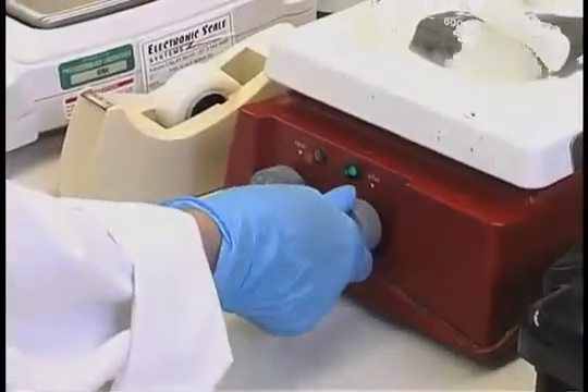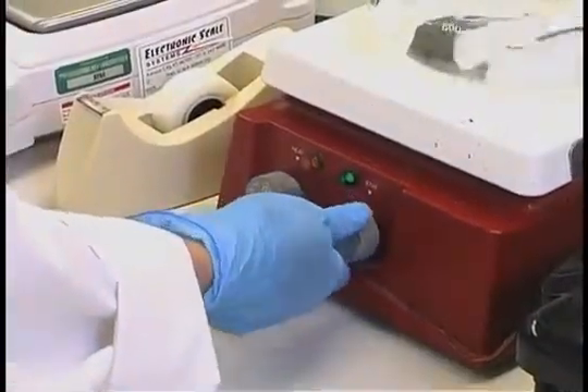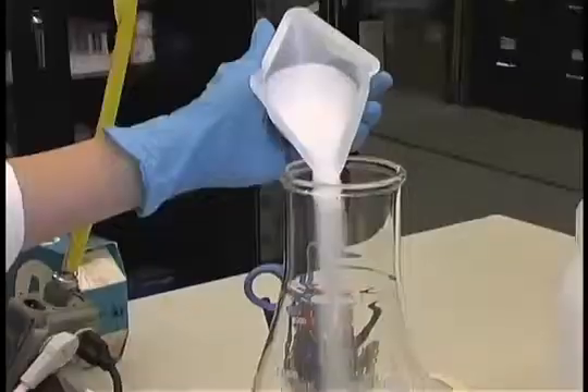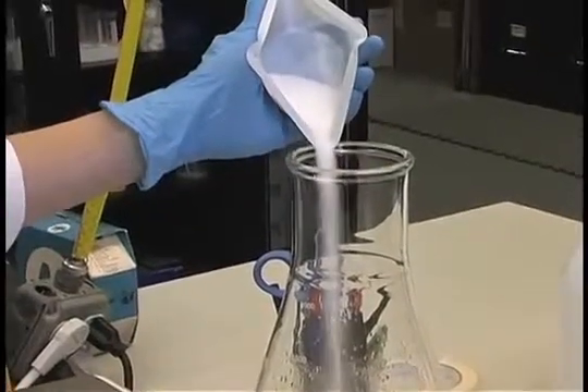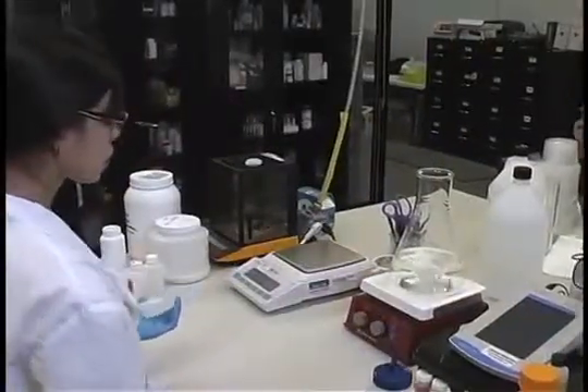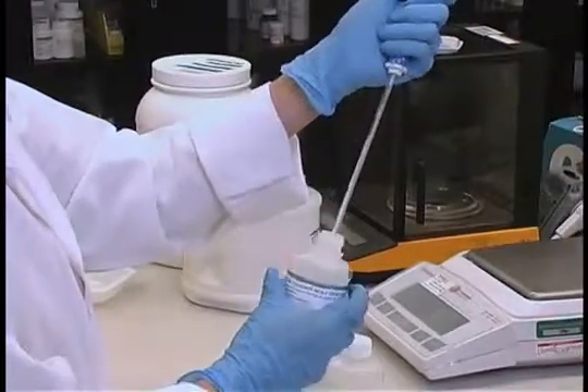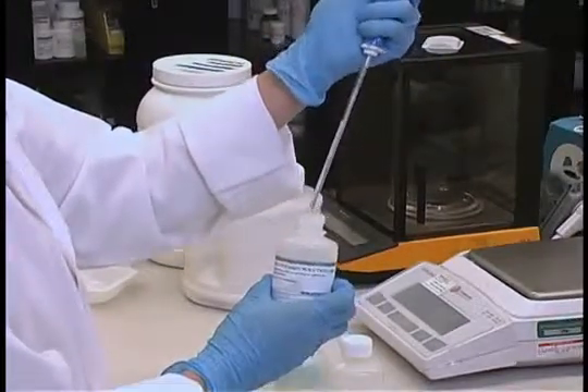Add a stir bar to the container and begin slowly stirring the water. Slowly begin adding the dry components to the medium being made, and stir each component until dissolved.